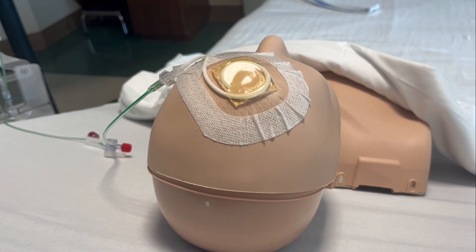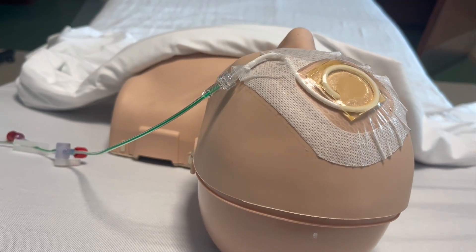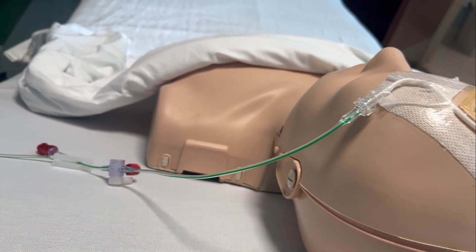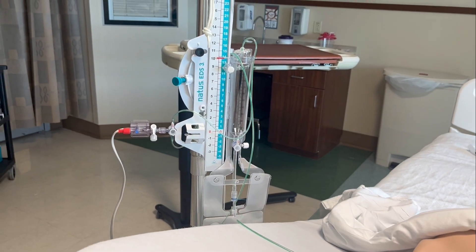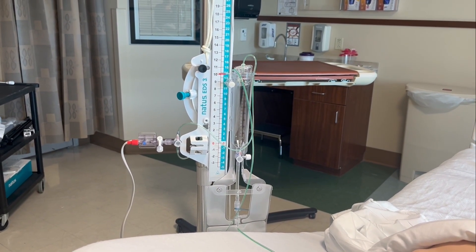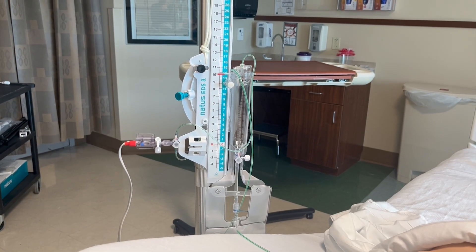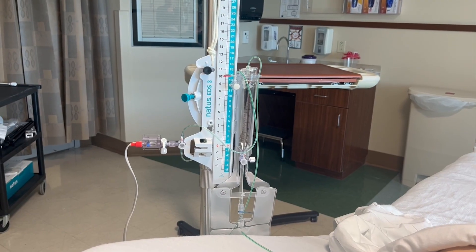Because the volume of the skull is fixed, brain swelling, hemorrhage, or an obstruction in CSF flow can increase the intracranial pressure. As the intracranial pressure rises, the cerebral perfusion pressure will decrease. Too much of a decrease in the cerebral perfusion pressure can cause the brain cells to die. Having an EVD drain inserted may reduce morbidity and mortality by helping relieve some of the pressure on the skull.